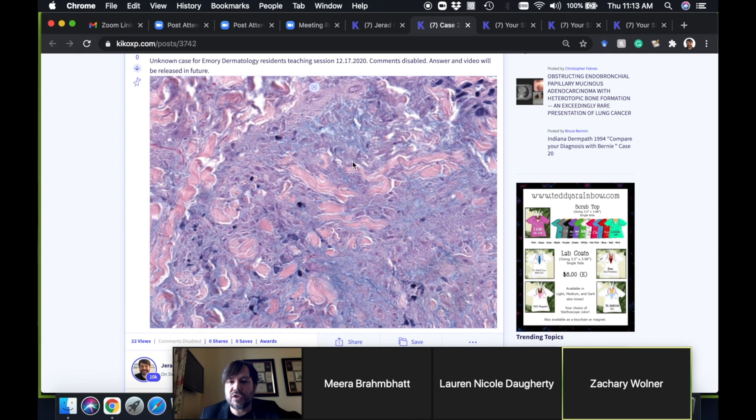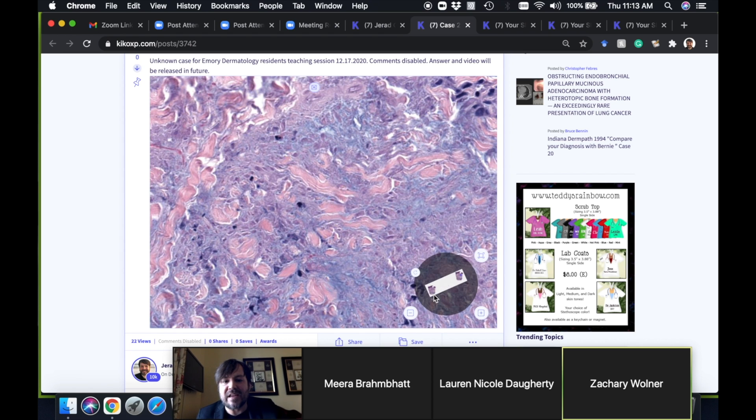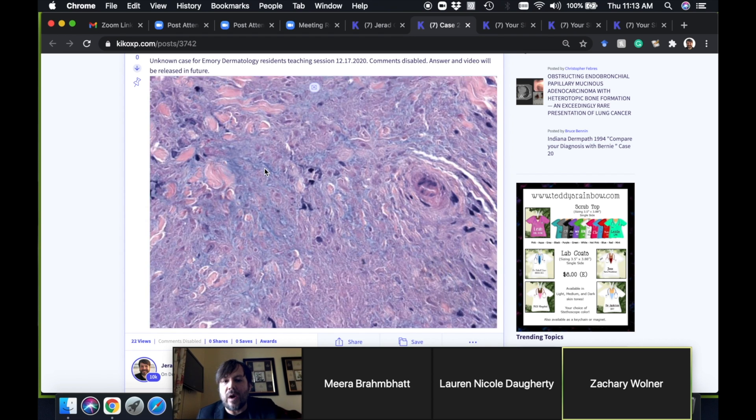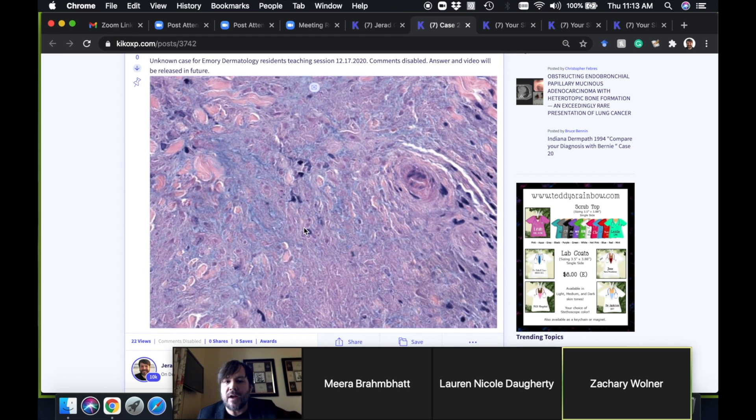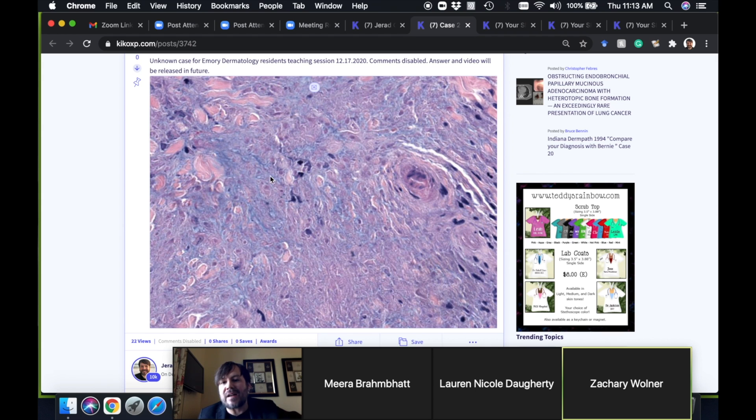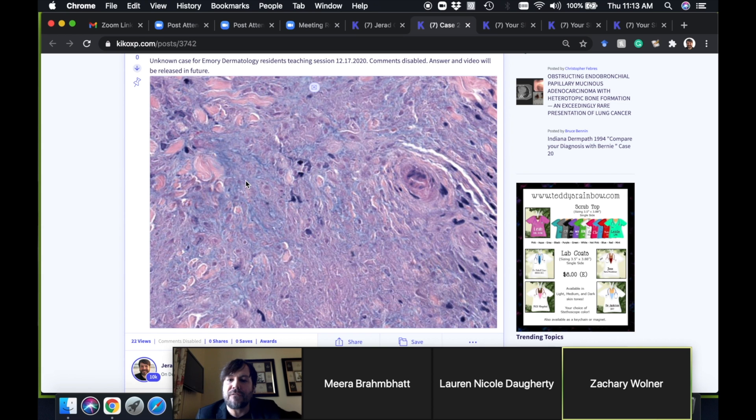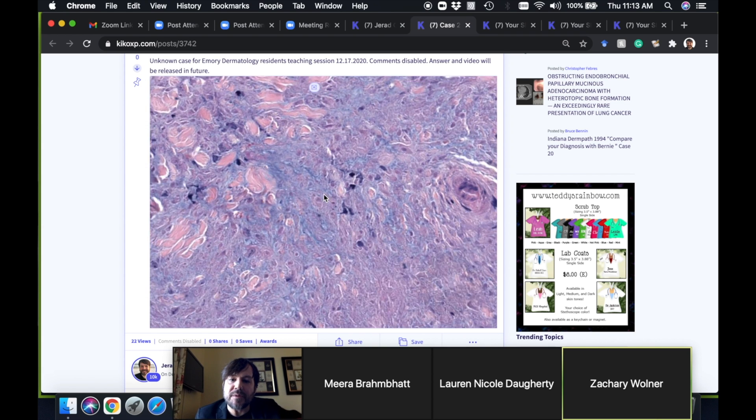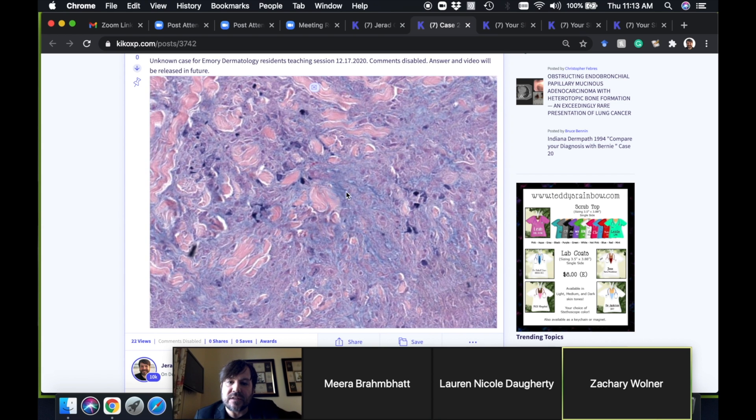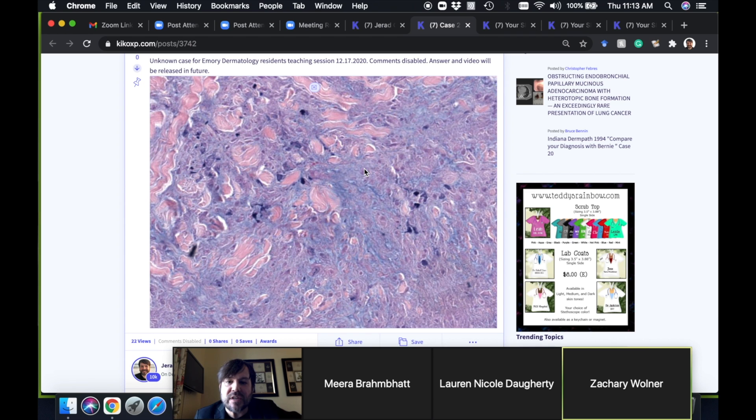Really the key to recognizing that necrobiotic appearance is the paucity of fibroblasts. As you get well-developed necrobiosis, you begin to lose those fibroblasts. You also begin to get blue mucin or myxoid.